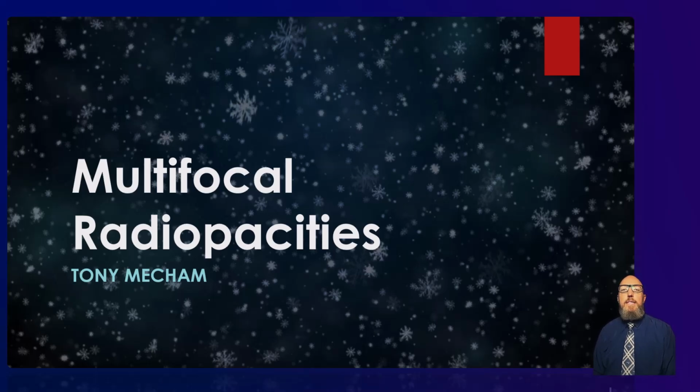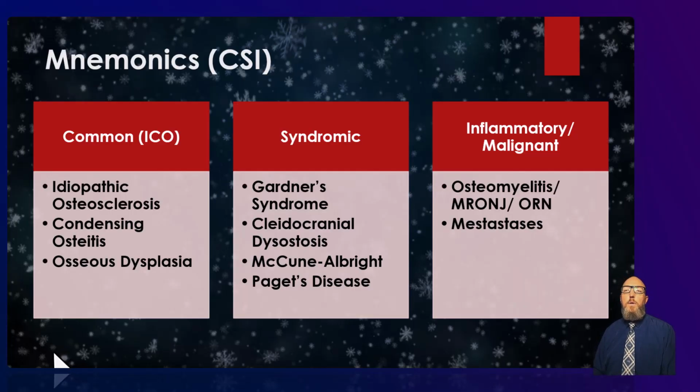This is topic 13, multifocal radiopacities. So once again, get your study guide out and have your chart handy. A quick orientation for this lecture, and this comes right out of your chart. We have this mnemonic CSI.